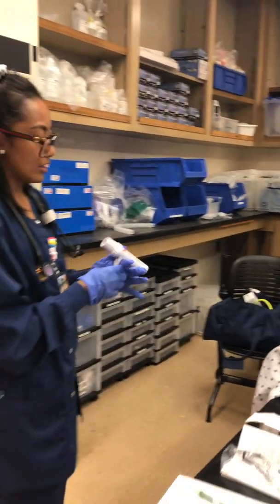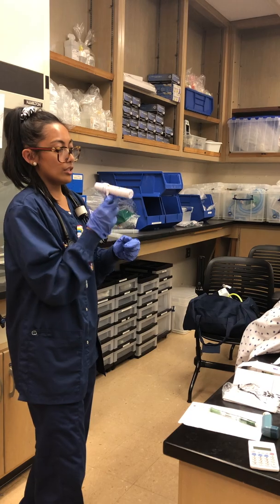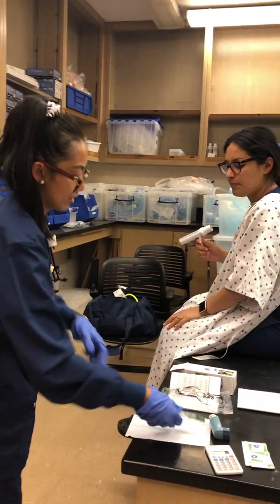So what we're gonna do is take a deep breath in and then blow out, surrounding the mouthpiece with your mouth and teeth and blowing out like you're blowing out candles, okay? Okay. So we're gonna do that 3 times to measure your breathing. Okay, whenever you're ready.